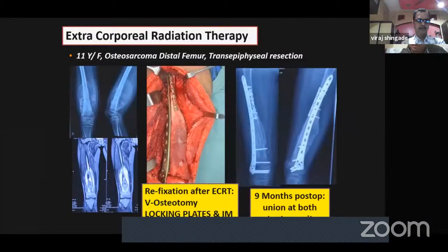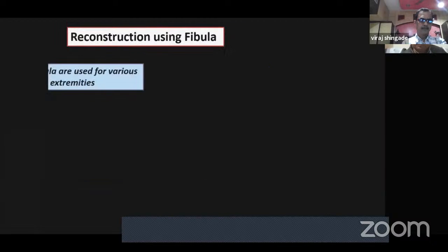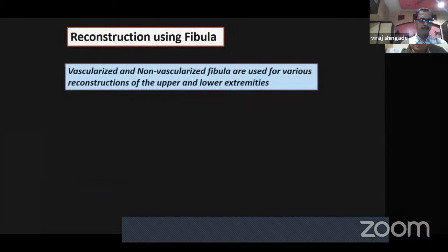These are the 9-month post-op x-rays showing union at both osteotomy sites. The mean time to union in our study was 7.9 months for the diaphyseal osteotomy and 5.9 months for the metaphyseal osteotomy. Reconstruction using vascularized as well as non-vascularized fibula.